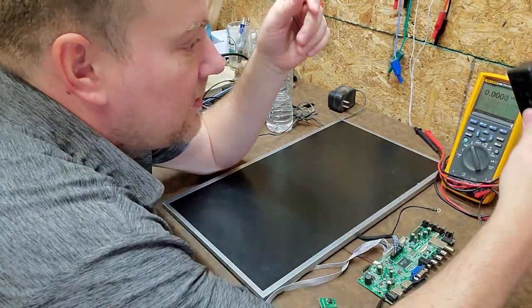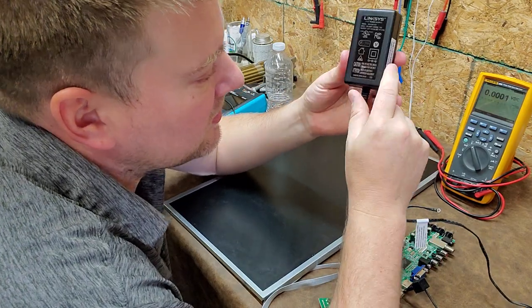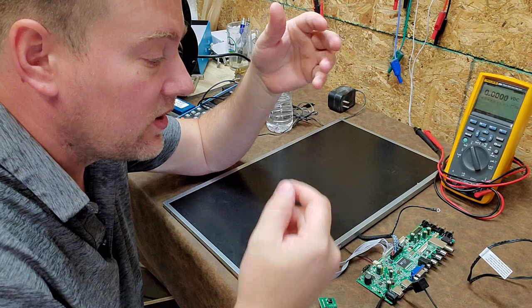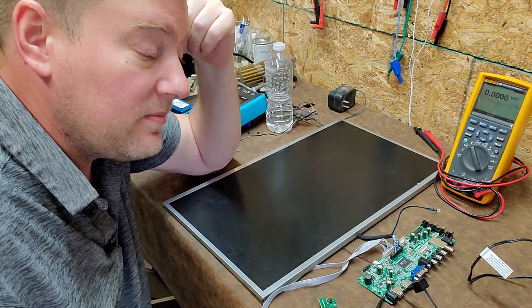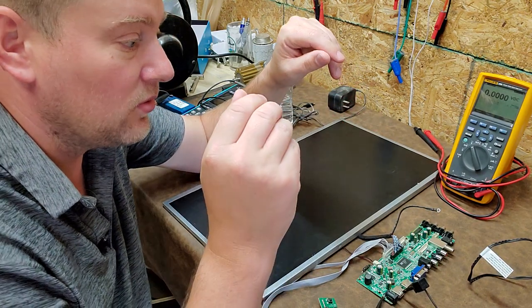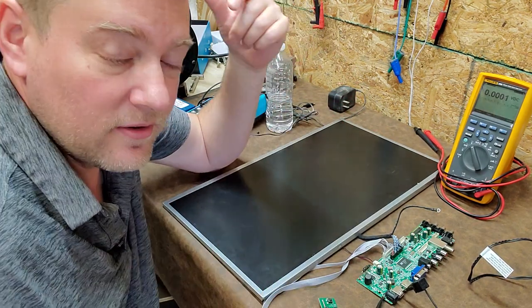So, guys, if you have these power bricks, these AC-DC adapters, keep some on hand. Wind the cord up nice and neat and keep them on hand because the day comes when you might need a very special power supply to repair a device or to test out a device and get it back up and going.